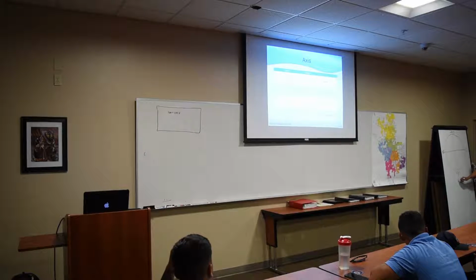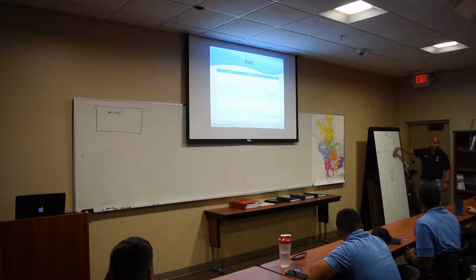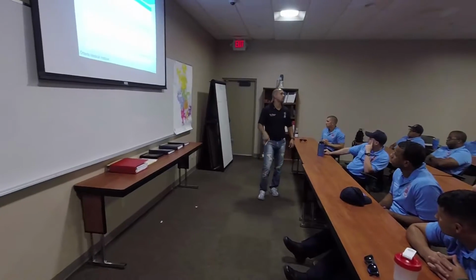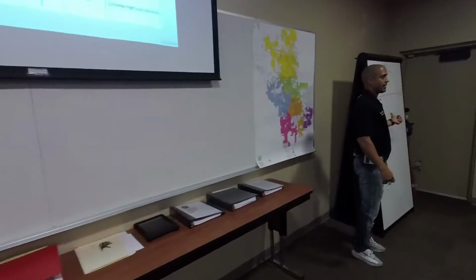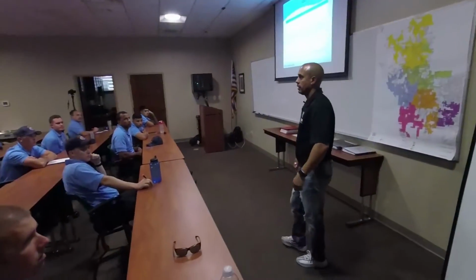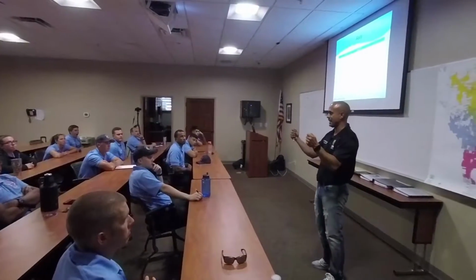And we know this is AVF, and lead 1, right? So if I'm 40, I'm around here somewhere, right? So is that normal? Normal axis. How about if I had 120, positive 120, or positive 130? Where would that be? Right here, right? So that would be what? Right axis deviation. How about if I had negative 30? Left axis. So that number can tell you right then and there if I got left axis deviation versus right and normal. You can look at that immediately.